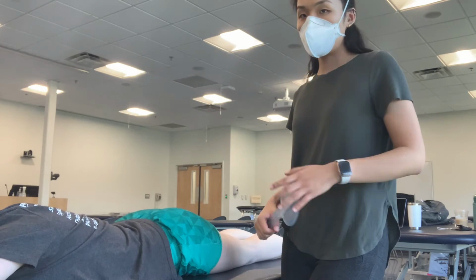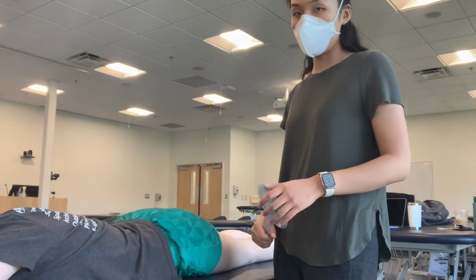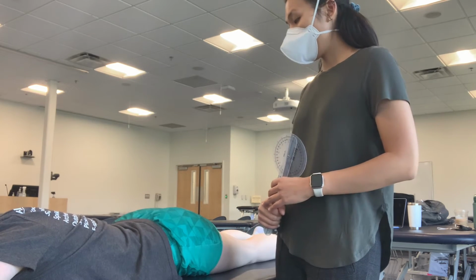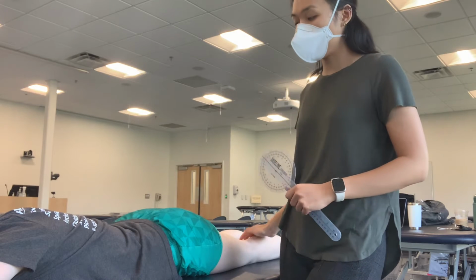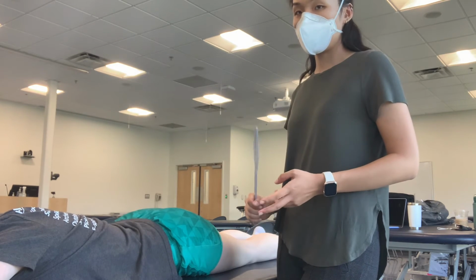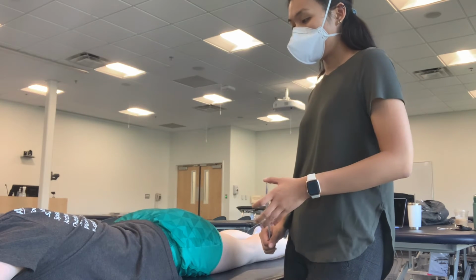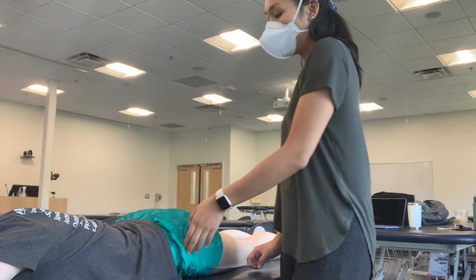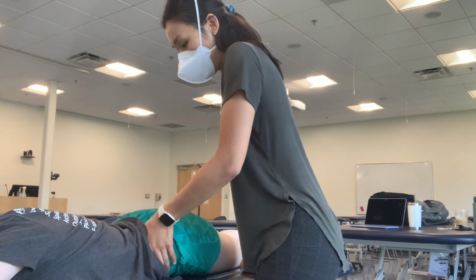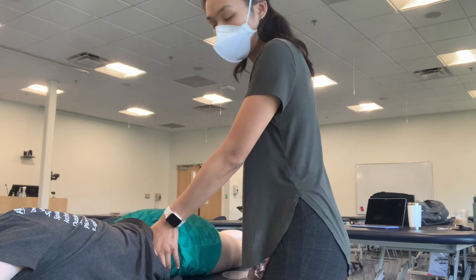So now we're going to test for hip extension. For hip extension, you want to make sure that the patient is prone and their pelvis is in neutral with the knees being extended, and you want to make sure that the hip is in 0 degrees of abduction, adduction, and rotation. To make sure that the pelvis is in neutral, we want to palpate the ASIS and the PSIS and make sure that they are vertically in line with one another.